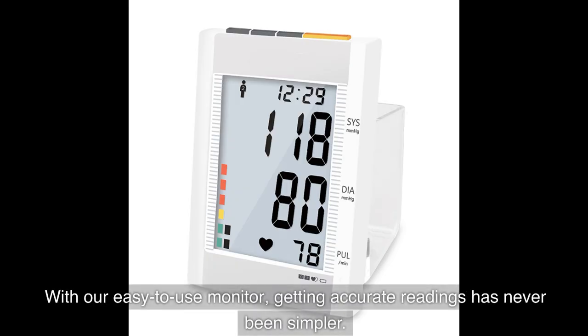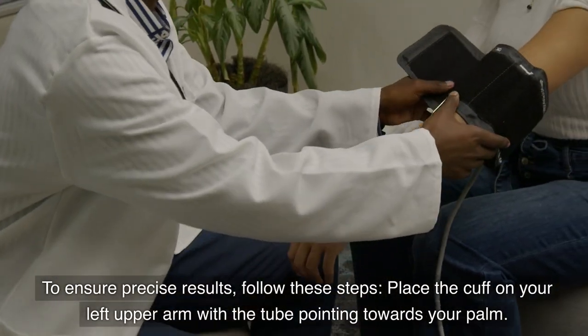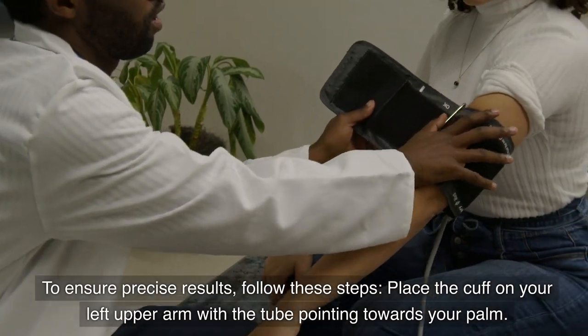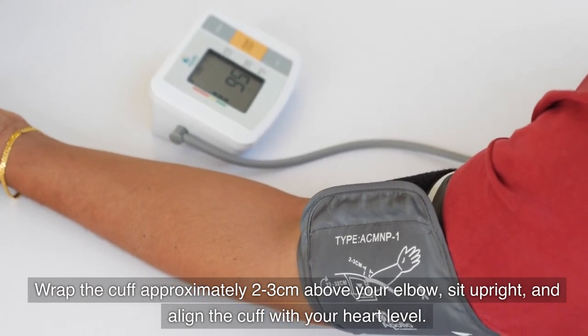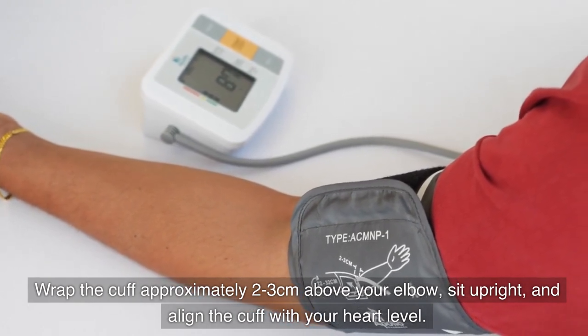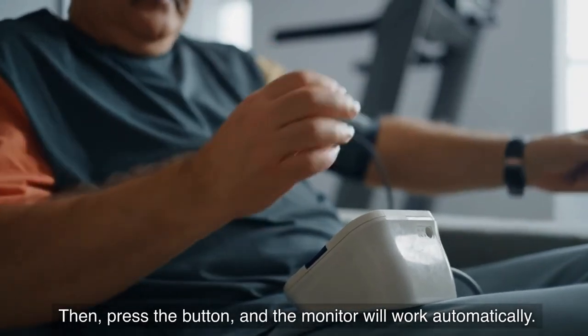To ensure precise results, follow these steps: place the cuff on your left upper arm with the tube pointing towards your palm, wrap the cuff approximately two to three centimeters above your elbow, sit upright and align the cuff with your heart level, then press the button and the monitor will work automatically.